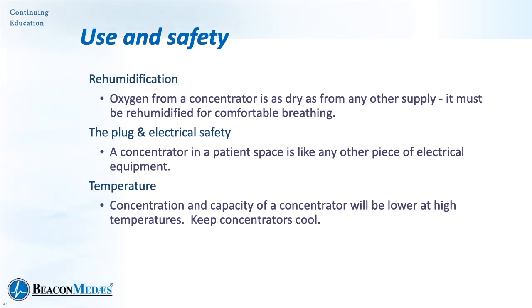Remember that oxygen from a concentrator is just as dry as oxygen from any other source. We want to make sure we rehumidify it for comfort in breathing. Remember that if we're using a concentrator, a portable concentrator in a patient space, just like any other piece of electrical equipment, if we trip over the plug, it's going to stop the concentrator. So we want to make sure we're paying attention to that.